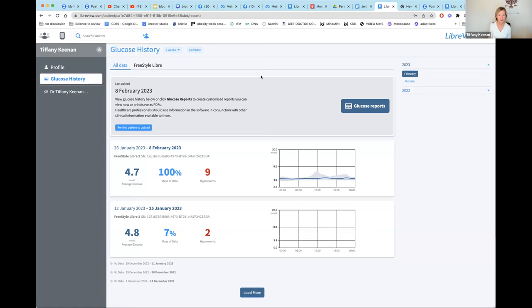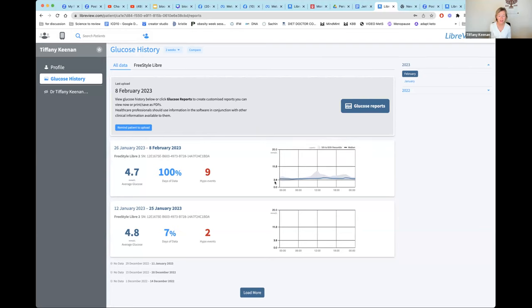You come to a basic screen that says 'Glucose History.' This gives you a little snapshot of what's going on. This sensor I wore was my Canadian sensor — my average glucose was 4.7. I wore it in January through early February. I really like this section because it gives me a quick snapshot as a doctor.